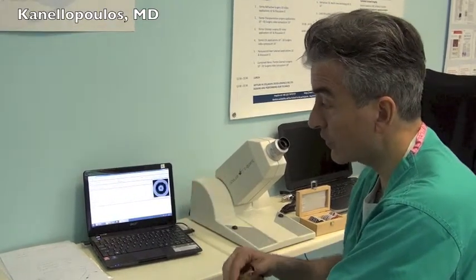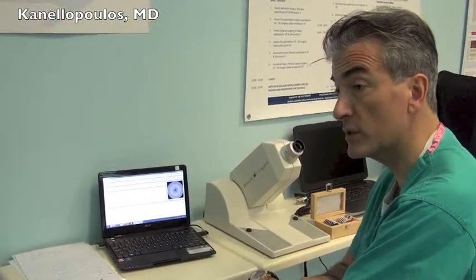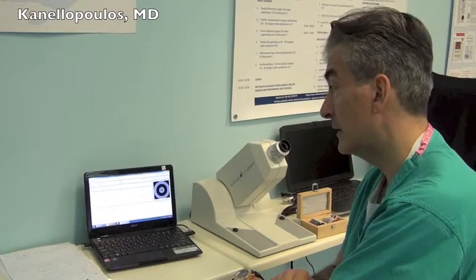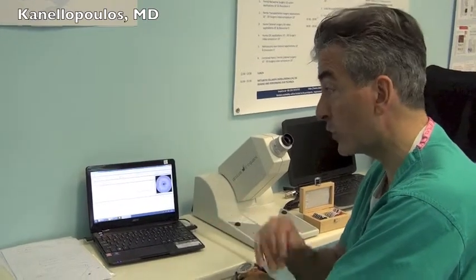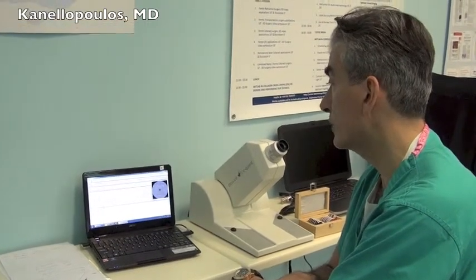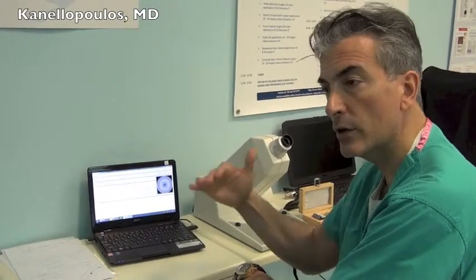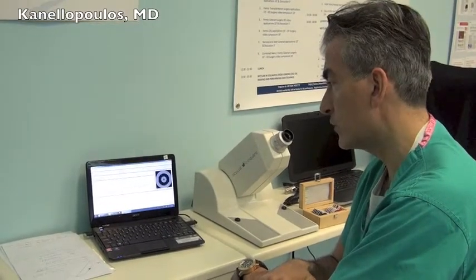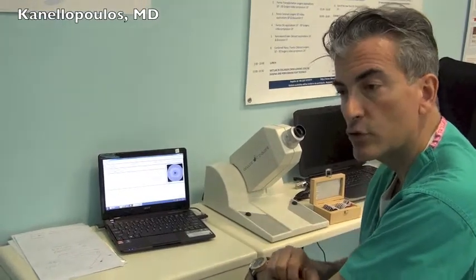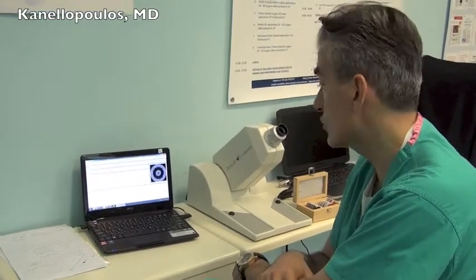And we can see very effectively in patients after 65, where we're starting to clinically see cataract development with the slit lamp, their ocular scatter increasing quite significantly. And the preliminary data, we've been working with this device a year and a half, makes us believe that this is the way that we're going to be also measuring visual function, as it is able to give us a higher level of visual function measurement. So we hope that this type of measurement will be incorporated in our routine refractive surgery and cataract surgery evaluation.